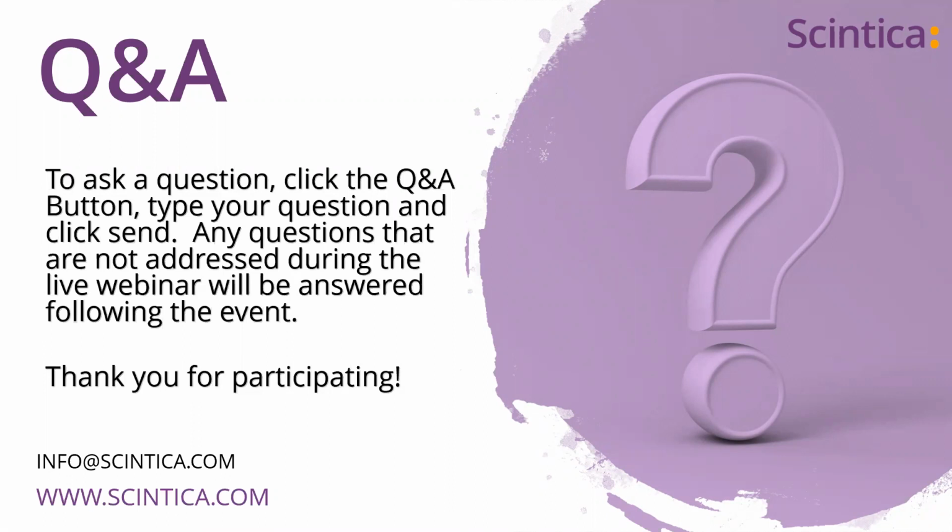One of the questions is, what is the maximum field of view? For the TriTom system, we're going to have the 3 additional webinars in the series coming forward starting in the fall, I believe. We'll look at the dates in a few weeks' time. But for the TriTom system, the field of view is 3 centimeters in height. And then obviously we're taking that and rotating it around the animal to generate a 3-dimensional tomographic image of the animal.